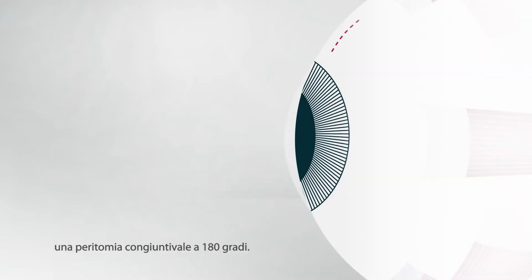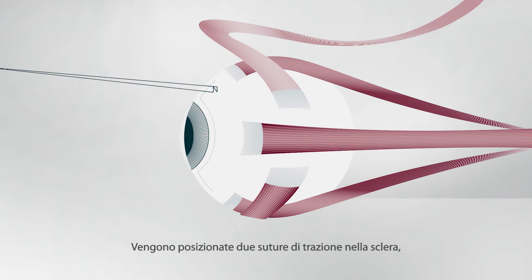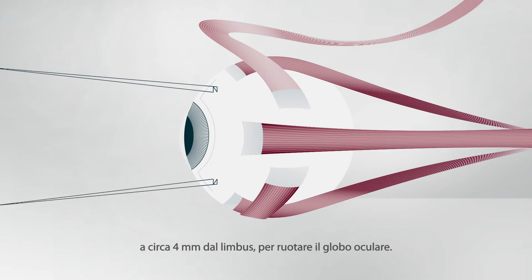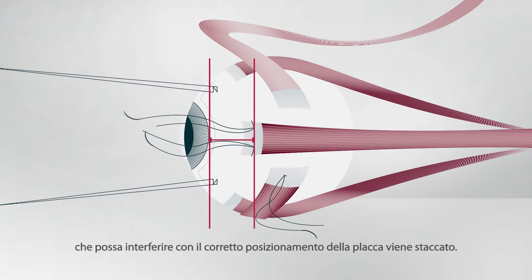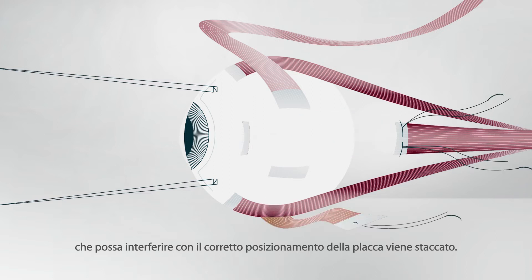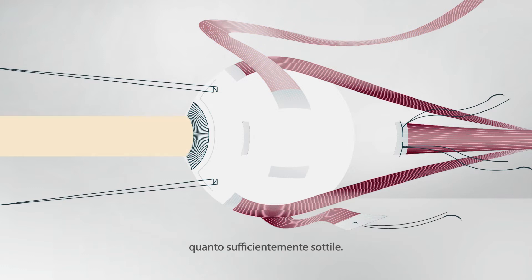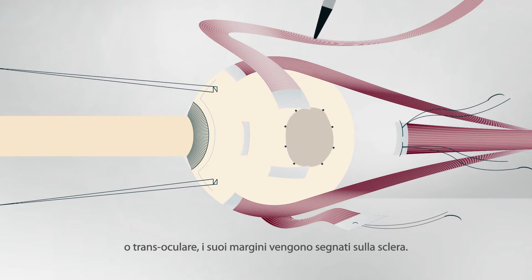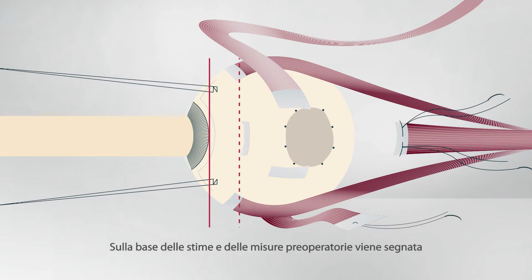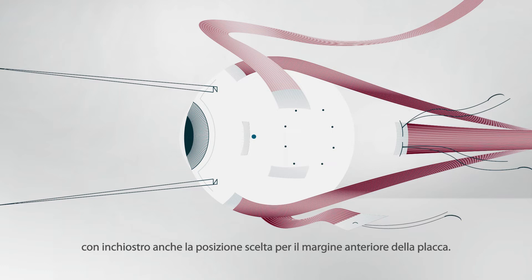During the operation, a 180-degree conjunctival peritomy is made. To rotate the globe, two traction sutures are placed in the sclera about 4 mm from the limbus. After placing sutures and measuring the knot to limbus distance, any muscles preventing accurate plaque placement are detached. The inferior oblique muscle is only detached if it overlies the tumor. However, the superior oblique muscle is left in place because it is thin. The tumor is localized by transpupillary or transocular transillumination and its margins are marked on the sclera with a pen. According to preoperative measurements and estimates, an ink mark is also made on the sclera at the intended location of the anterior plaque edge.